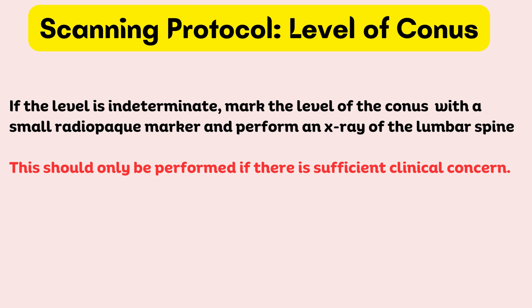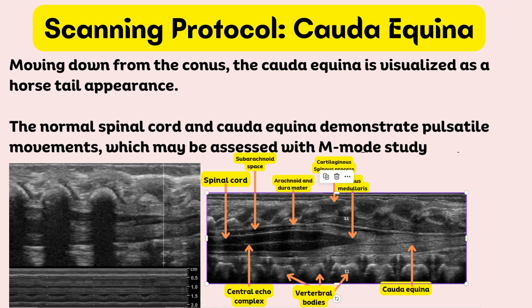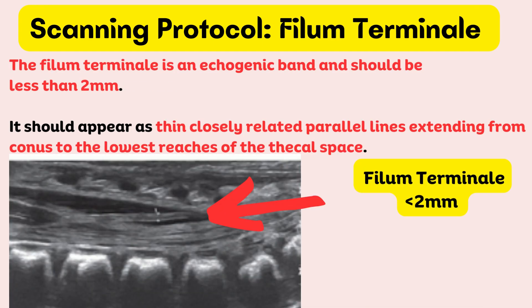A potential pitfall with the rib-counting method is that some people have 11 or 13 pairs of ribs, so both methods should be used to improve accuracy. If the level is indeterminate, mark the level of the conus with a small radiopaque marker and perform an x-ray of the lumbar spine — this should only be performed if there is sufficient clinical concern. Moving down from the conus, the cauda equina is visualized as a horsetail appearance. The normal spinal cord and cauda equina demonstrate pulsatile movements, which may be assessed with M-mode study. The filum terminale is an echogenic band and should be less than 2 mm, appearing as thin closely related parallel lines extending from the conus to the lowest reaches of the thecal space.